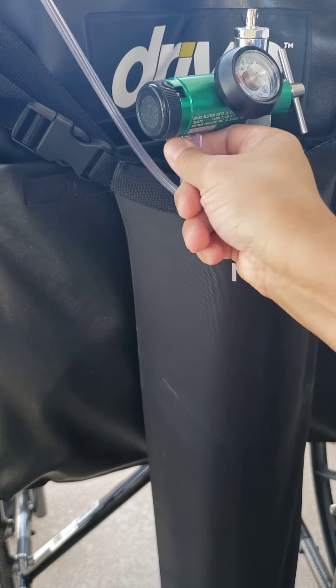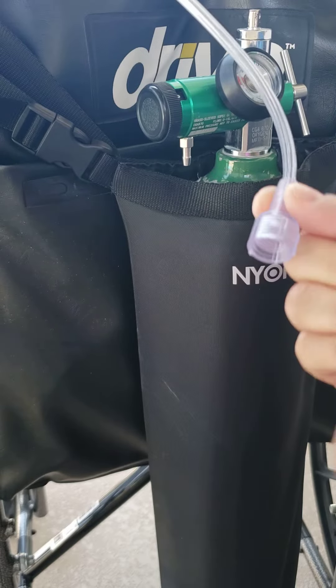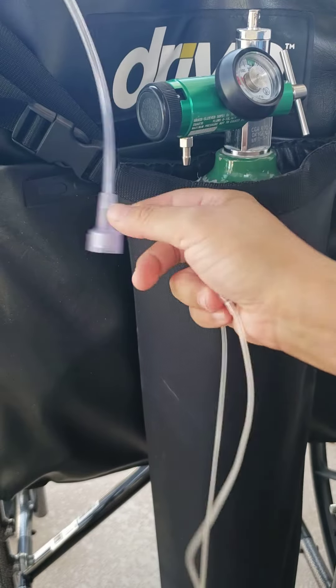So if you have this thick tubing here that will not fit on the end of the kink clear, don't worry about it — there's a solution.